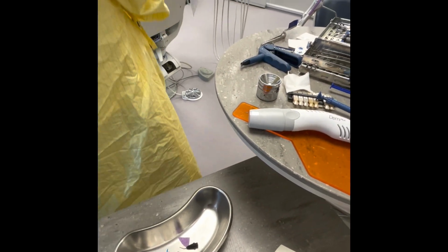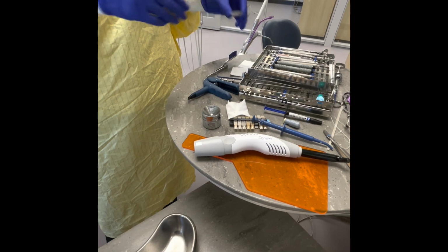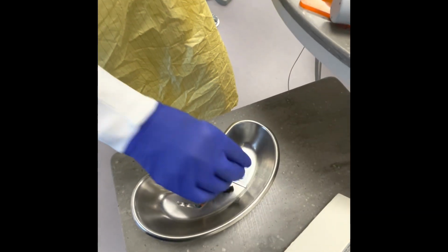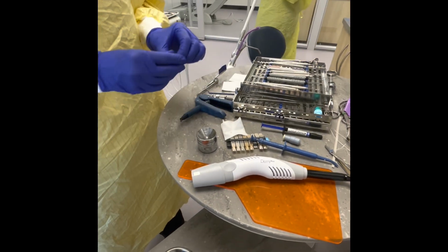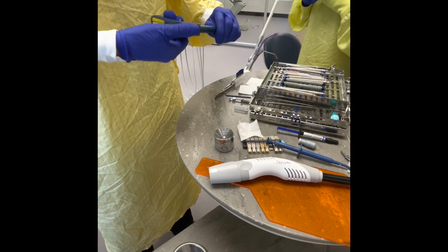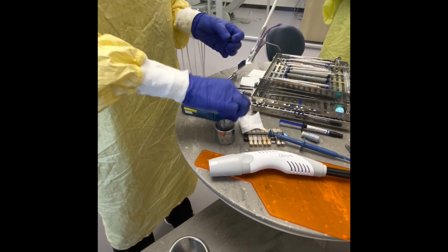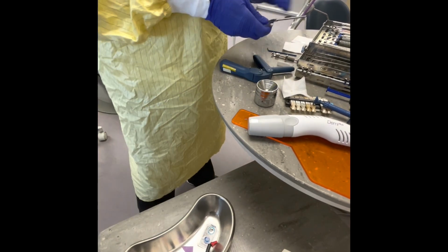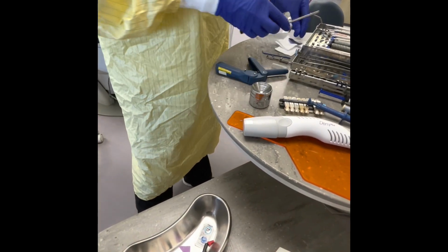I'll just throw that blue one in there as well. My bonding system will go in there. Okay, any composite that I didn't use will go in there as well. Okay, and the rest can just all go in the garbage, so I'm not worried about that.